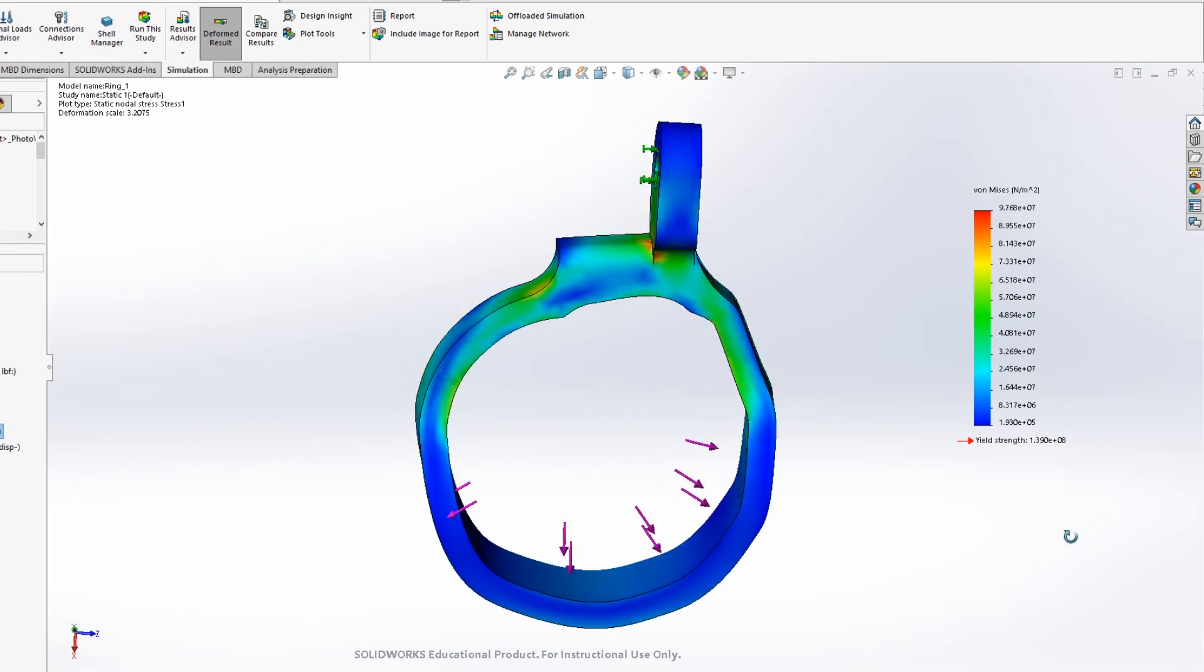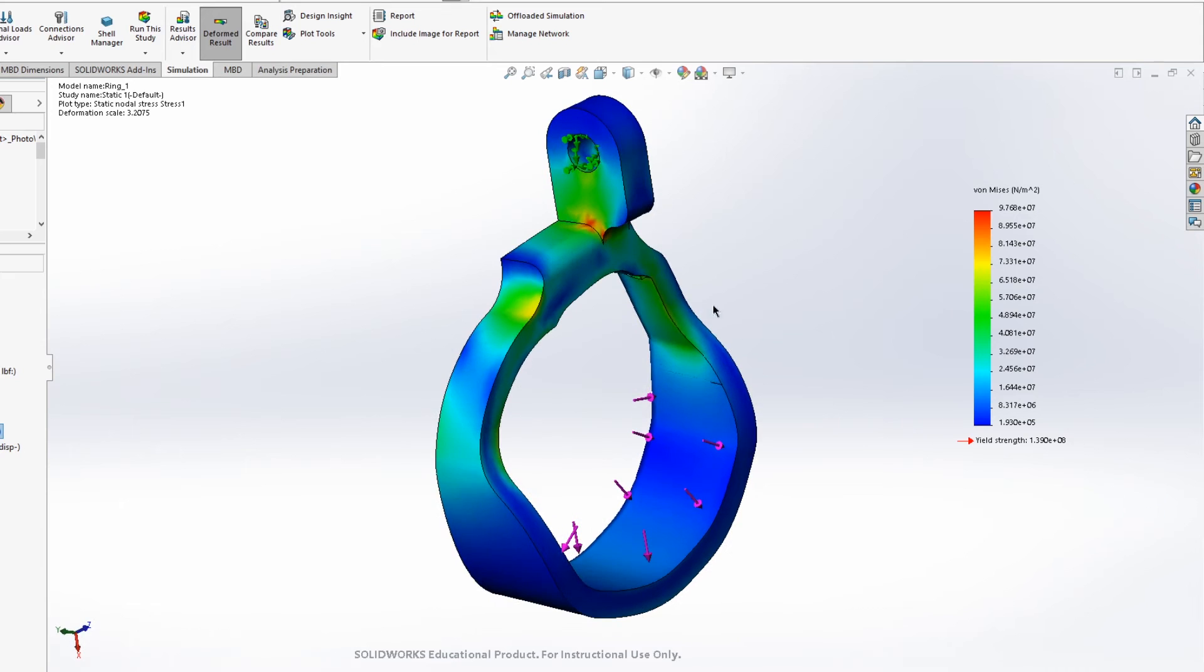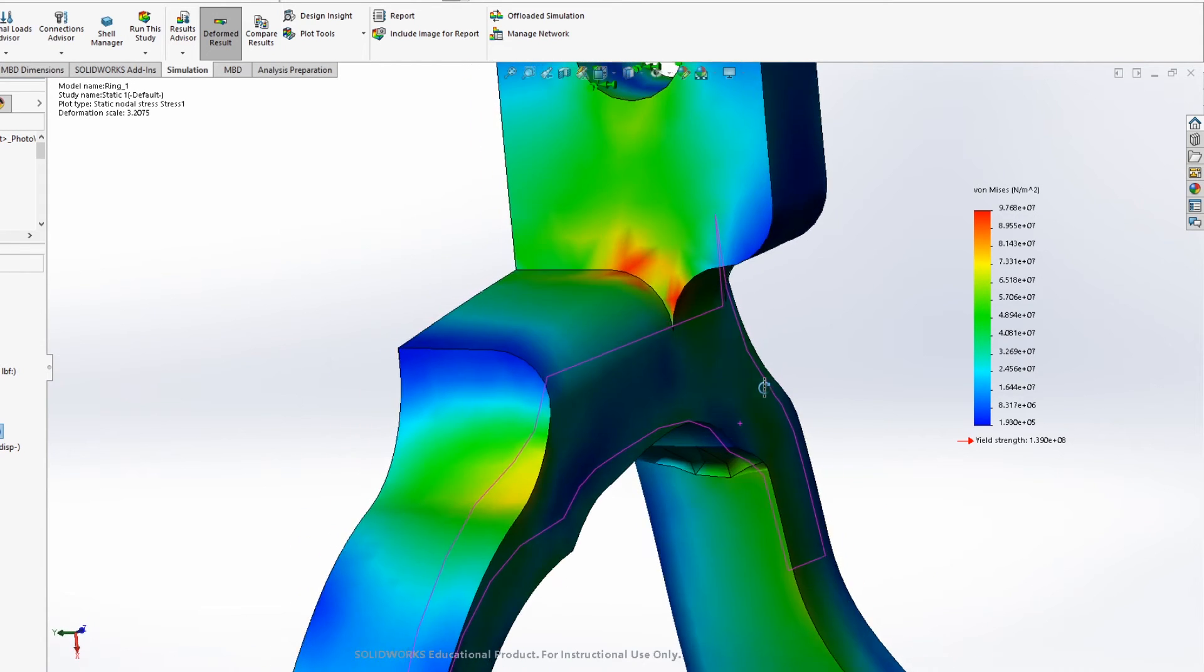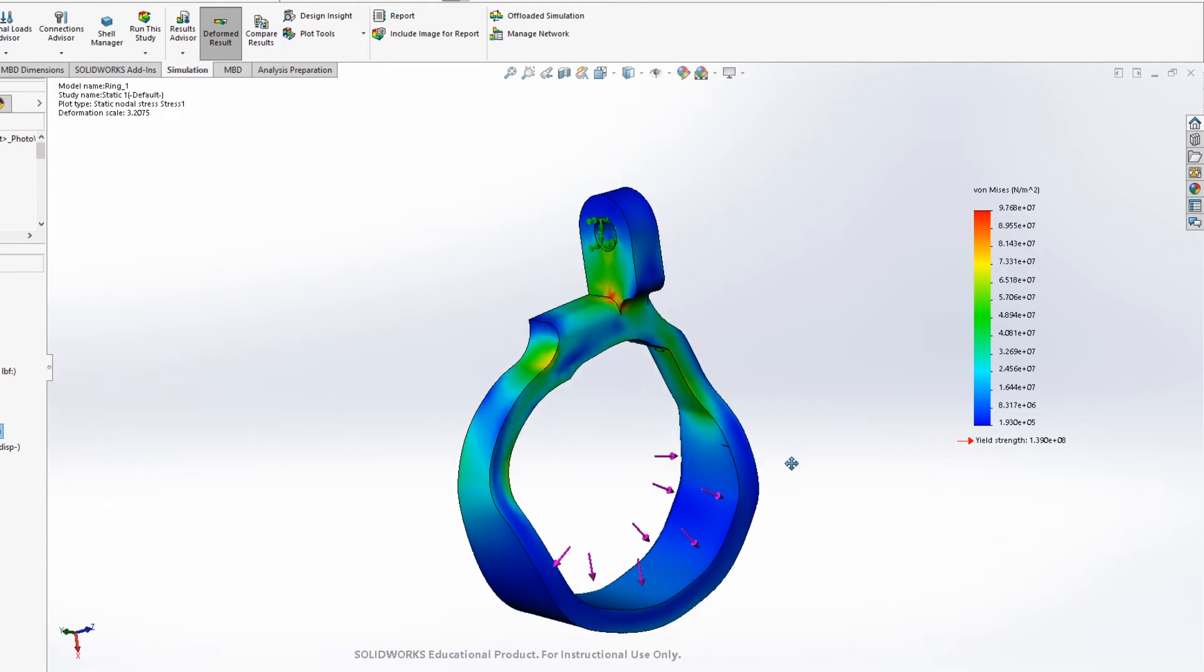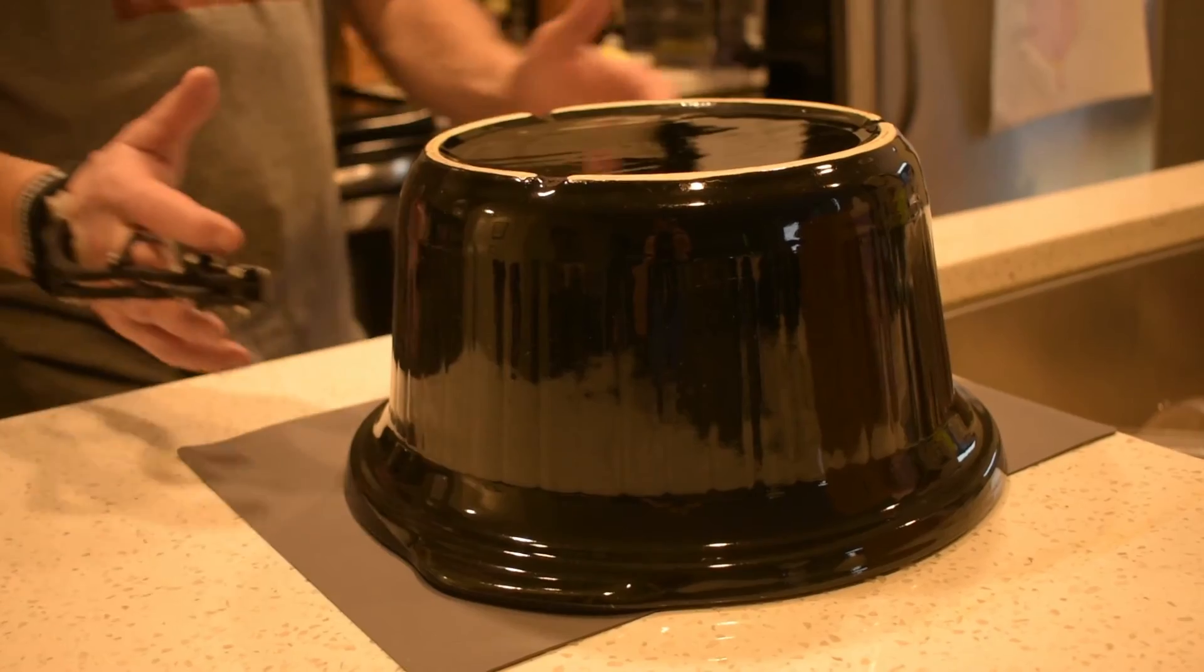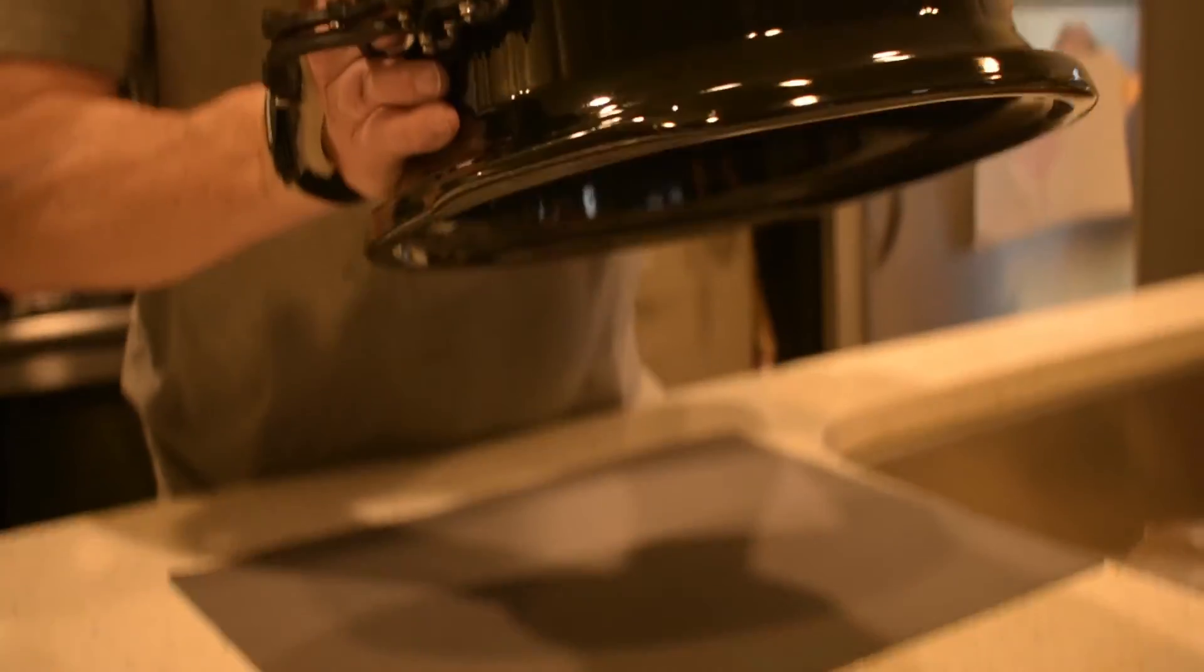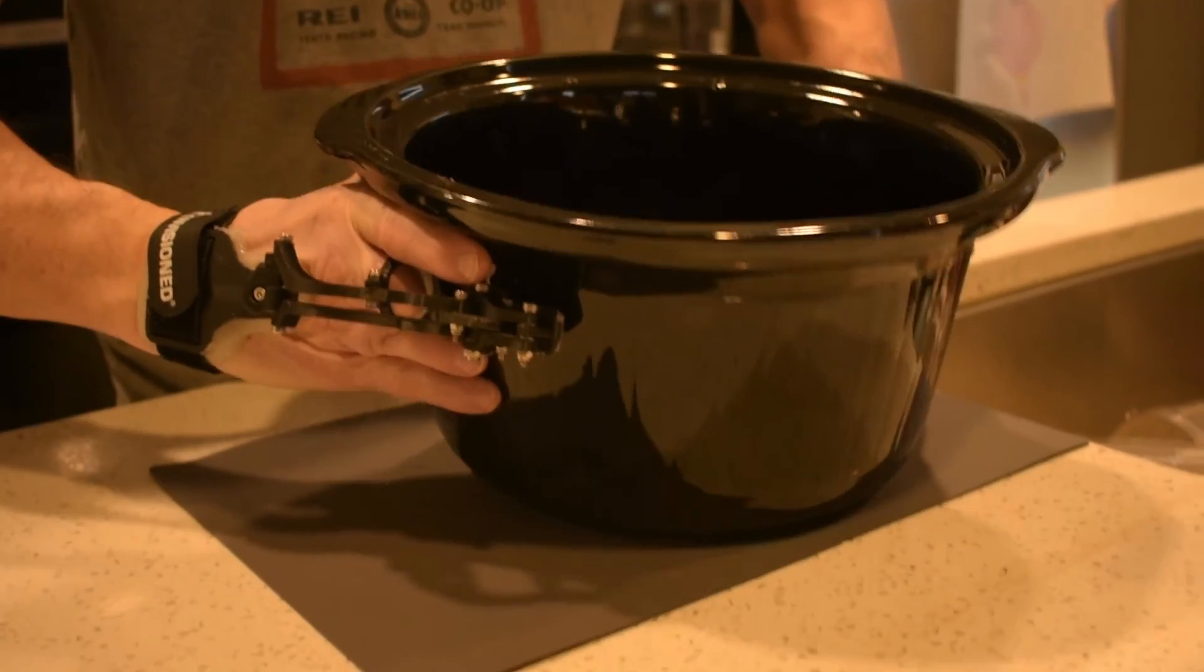A quick finite element analysis in SOLIDWORKS shows that the ring can likely support a static load of about 25 pounds, although this could be drastically increased by a design change that eliminates the stress concentration at the top of the ring. But the finger restored both fine motor skills of the middle finger as well as increased grip strength of the hand.